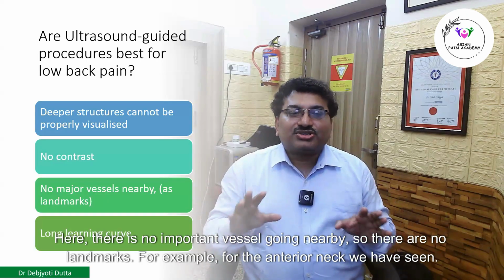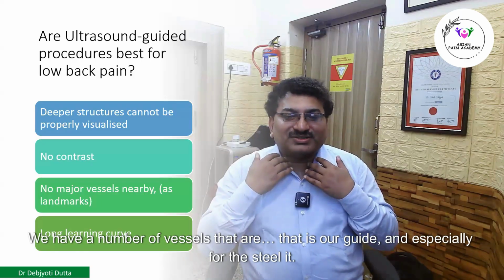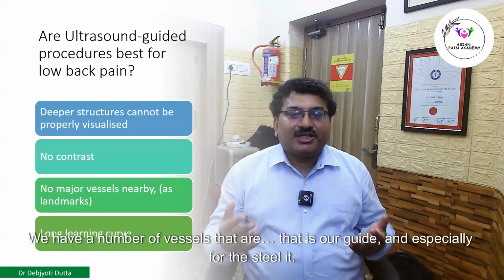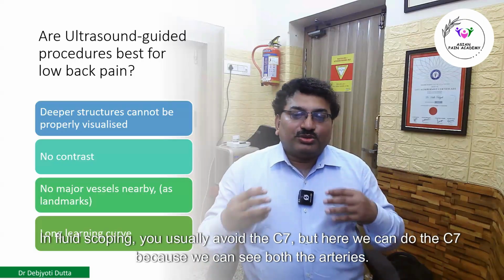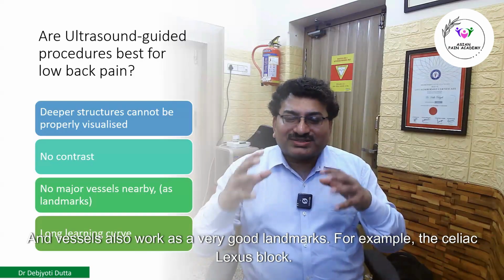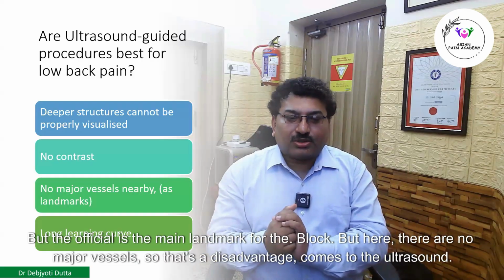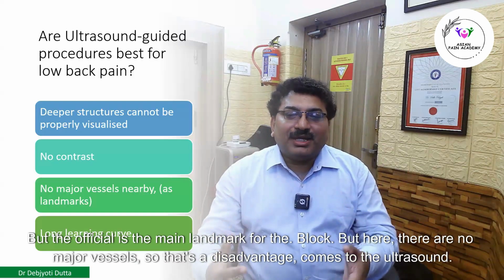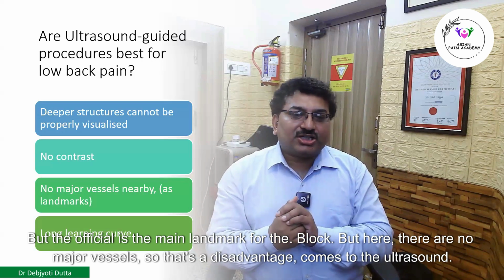For example, for the anterior neck, you have seen we have a number of vessels that are our guide, and especially for the stellate. In fluoroscopy, you usually avoid the C7, but here we can do the C7 because we can see both the arteries. And vessels also work as very good landmarks. For example, the celiac plexus block, but the vessel is the main landmark for the block. But here there are no major vessels, so that's a disadvantage when it comes to the ultrasound.